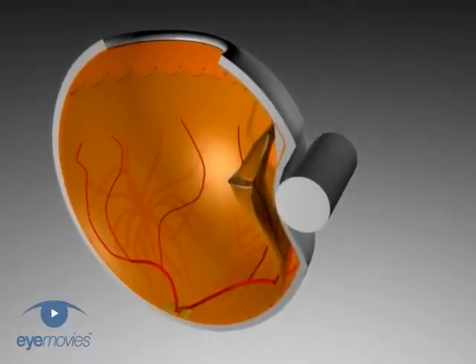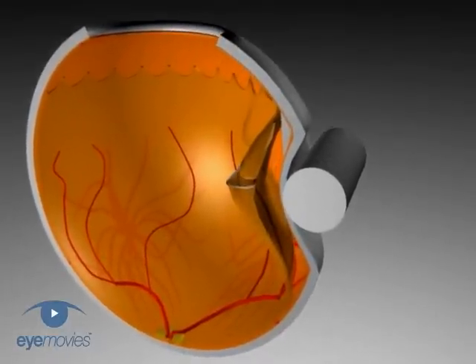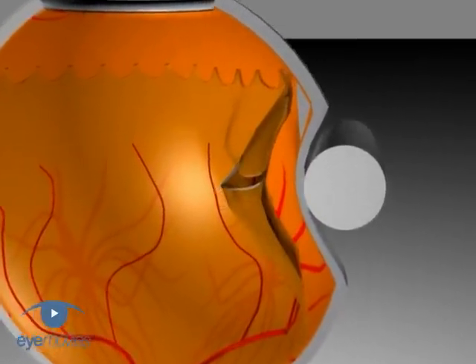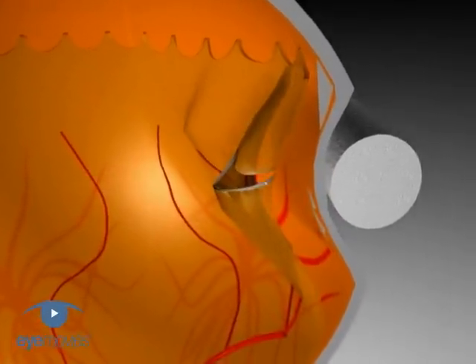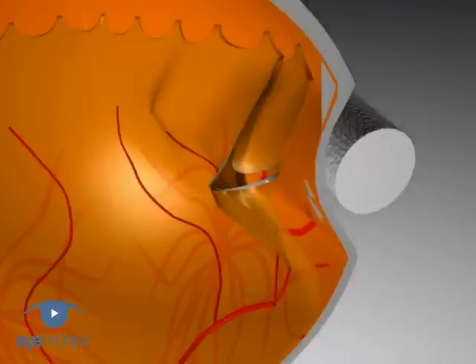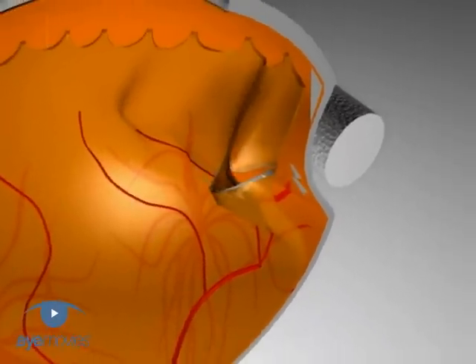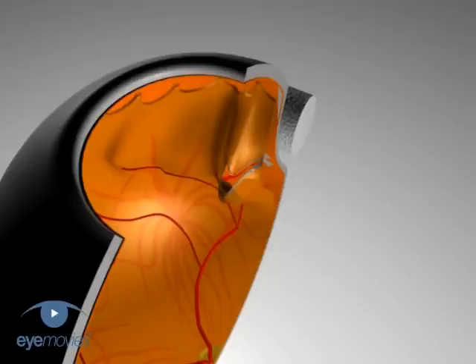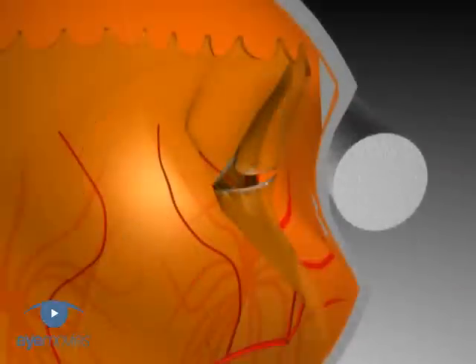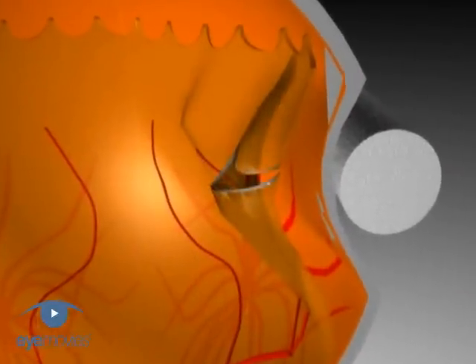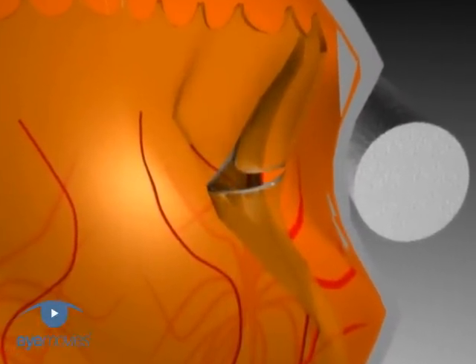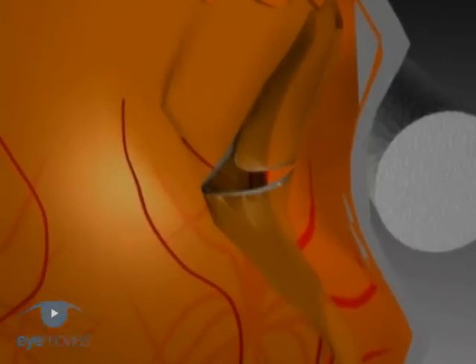Use of a circumferential sponge on a large U-tear may lead to redundant retina forming radial folds through the tear. As a result, the tear remains open and adopts the configuration of a fish's open mouth. This does not occur with radial sponges.